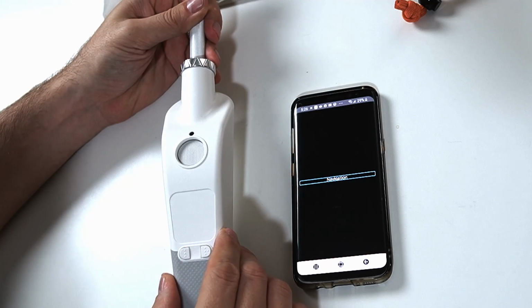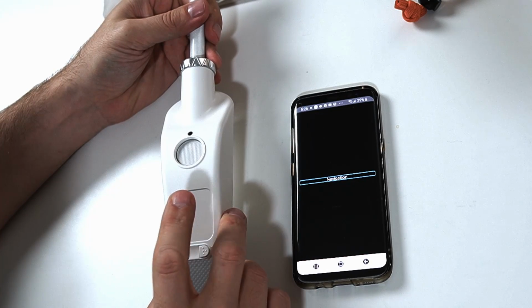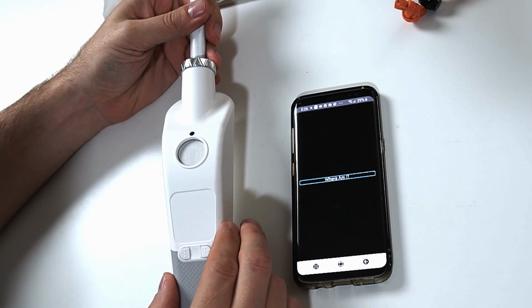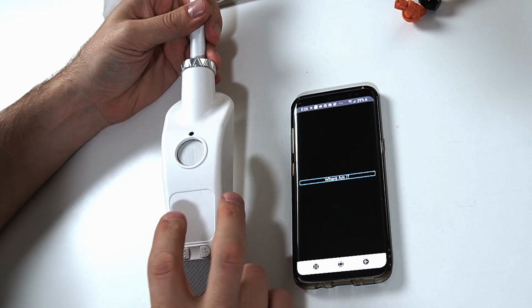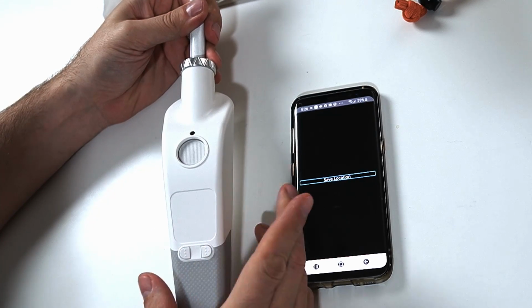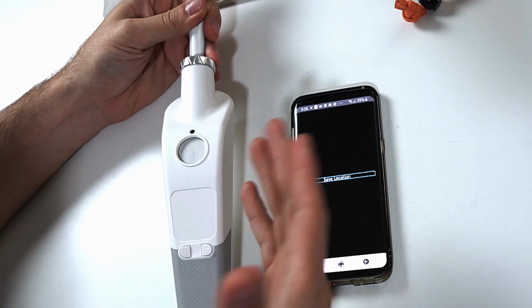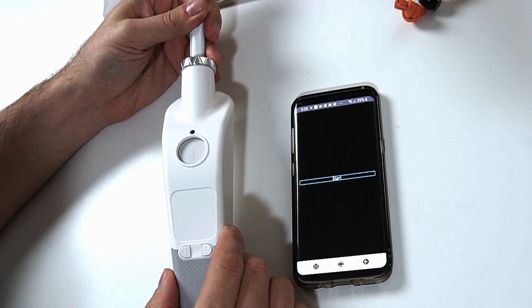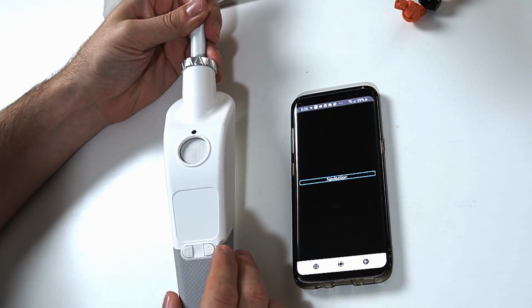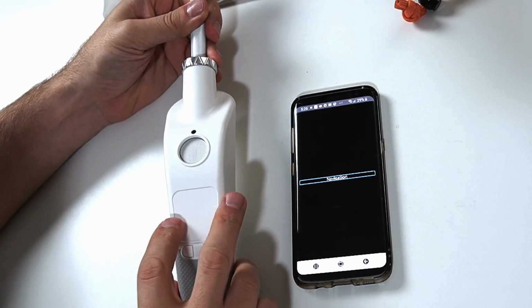Navigation. And then we're back to navigation. Start. Where am I? Save location. You can pull up one of your saved locations and navigate to that. Start. And back to start. Swiping down takes you back in the menu.